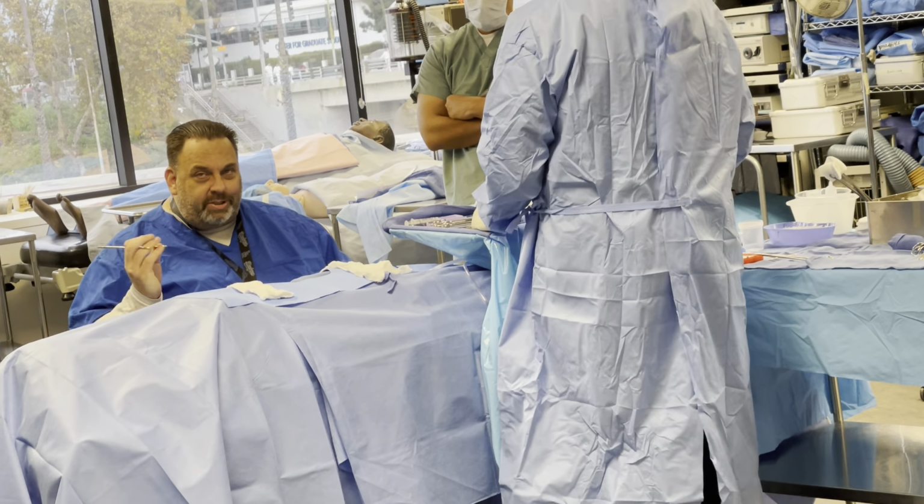Okay. Now, say we're doing suture now, right? And I'm suturing. Count suture. 1 working. 2, 3. So those are different. If I'm using it, it's called working. But up here, it's called the field. Why do we say that when we're counting?